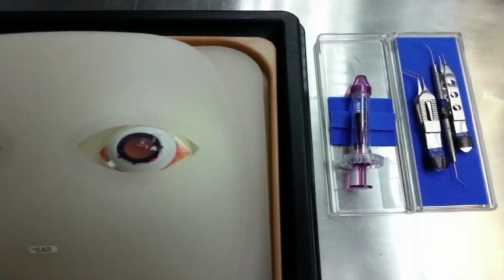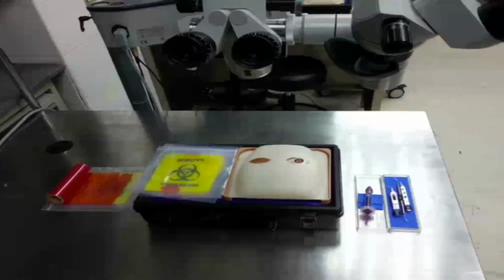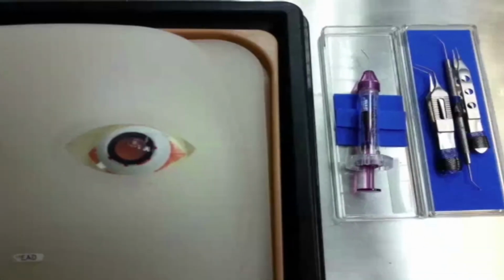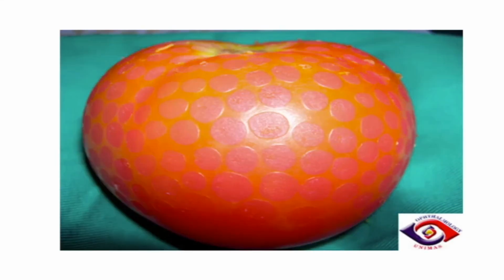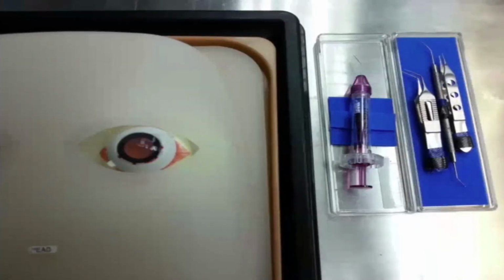I'll just show you. The capsule here is just a normal capsule, and it comes with a price as well. So put a capsule there, and you can practice your CCC and also the can opener. The capsule can resist many times, as long as it is there. If not, you can always purchase it by yourself, because the instrument is free, as long as you are not going to spoil it.